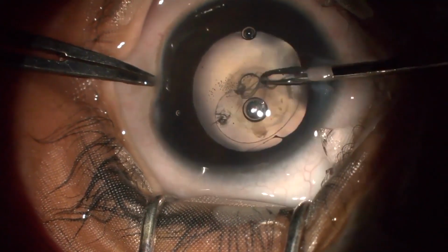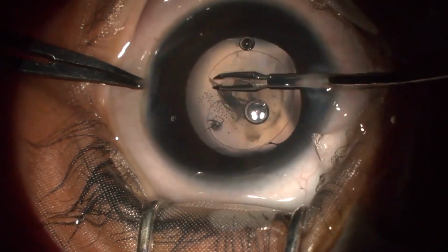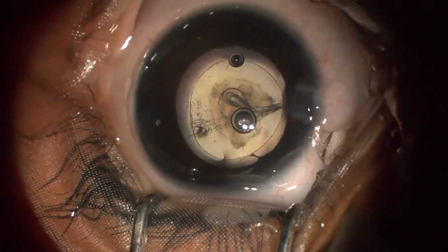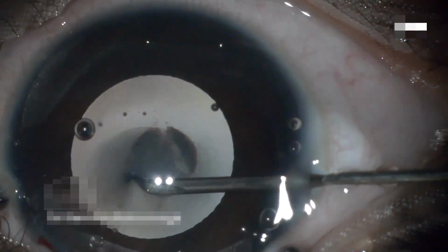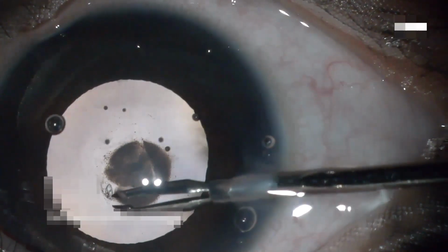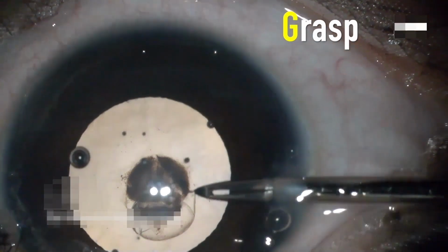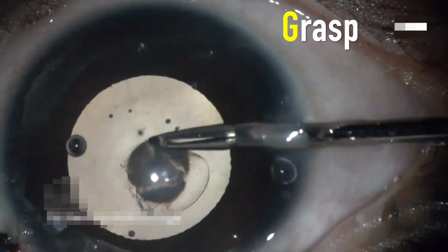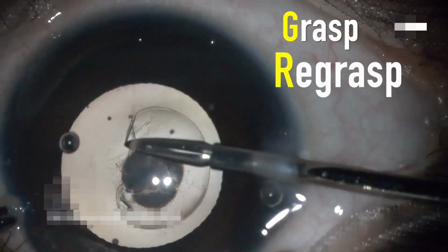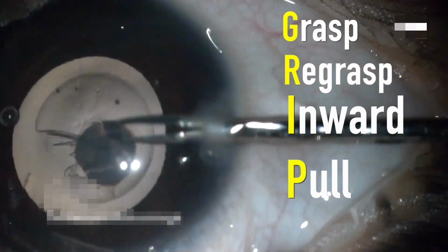The manual continuous curvilinear capsulorhexis using the microrhexis forceps is the gold standard for capsulotomy in children. After an initiation of capsulorhexis by a cystotome, the free edge of the capsulotomy flap is grasped with rhexis forceps and a centripetal tearing force is applied. The capsulotomy flap is re-grasped at the leading edge of the anterior capsule and then pulled inward.